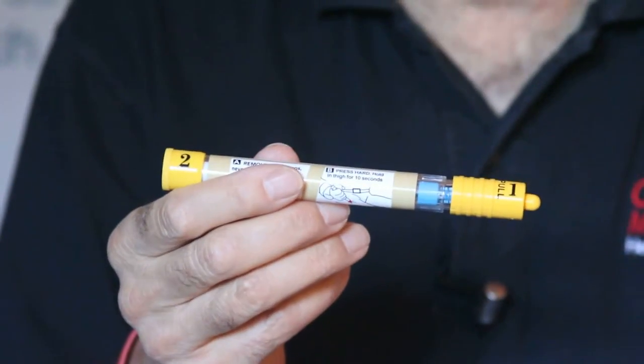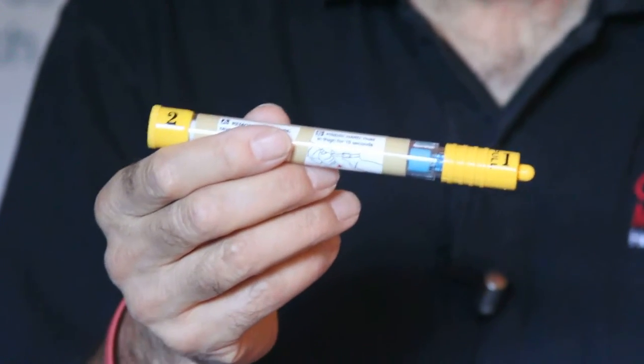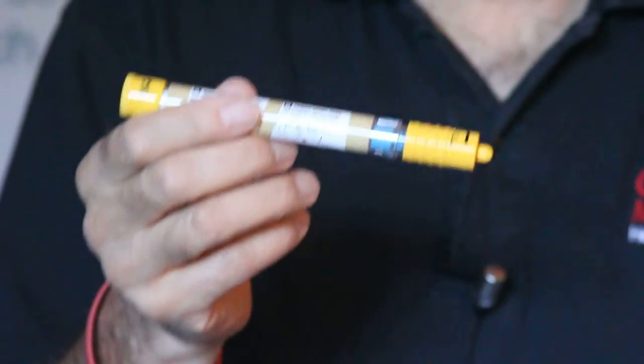There are two different sizes. One is adult — it's a 0.30 dose. The second is pediatric, which is half of that dose, or 0.15. Once again, this is only for use in anaphylaxis.